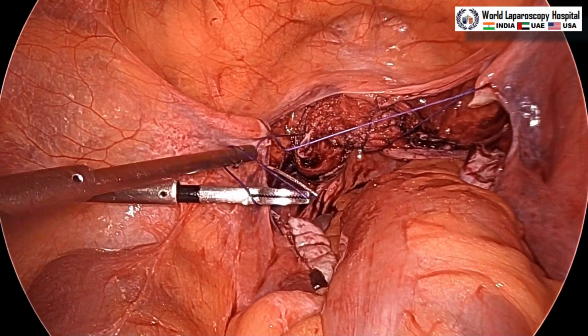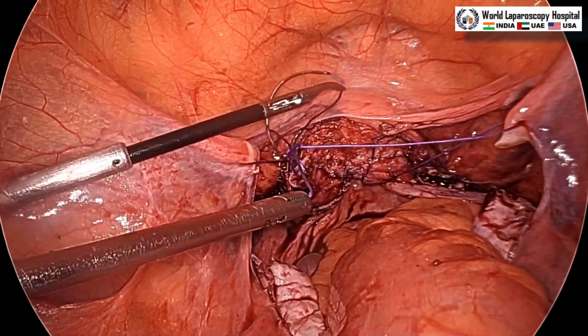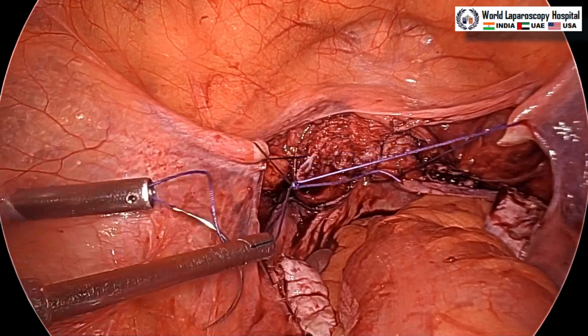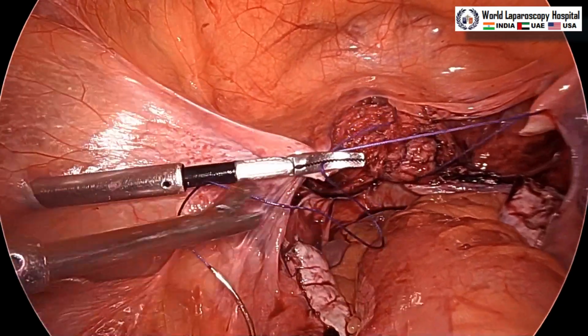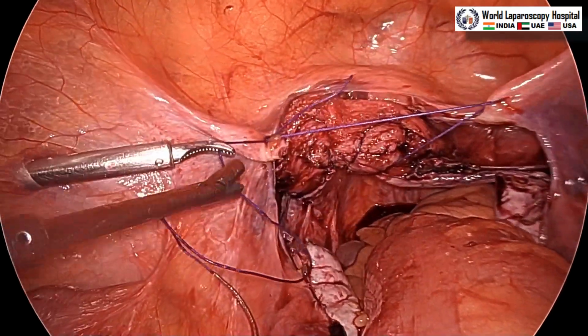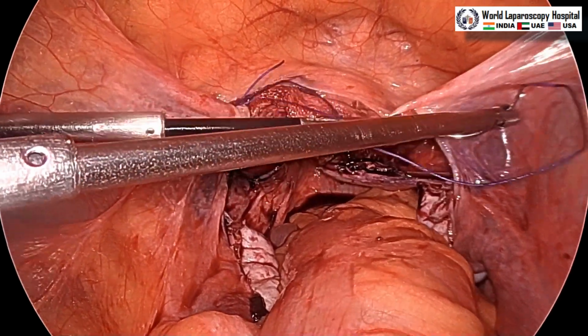So, that is a very good knot. This is called the tumble square knot. Tumble means falling straight. And now this needle end of the suture is getting straight, and now it is sliding. It will slide, and after sliding you can take a further bite to the right side and it can be slid further.